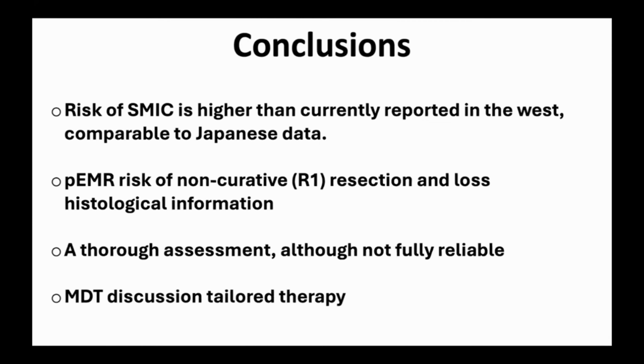So I would recommend to discuss this lesion in the MDT and tailor a therapy to the patient. But also, I think that we are witnessing a paradigm shift where we should use ESD for en bloc resection rather than EMR more and more. And this, I hope, would be the future.